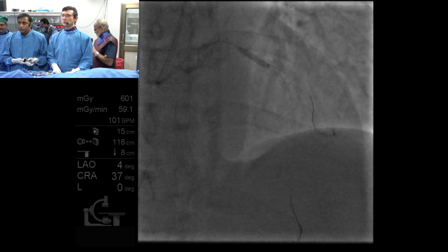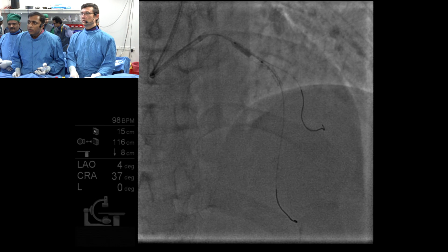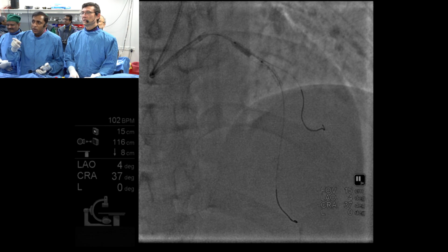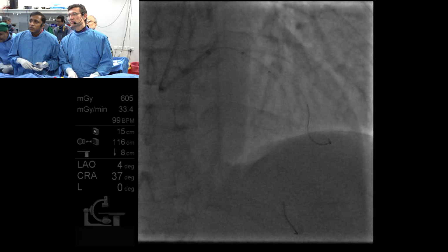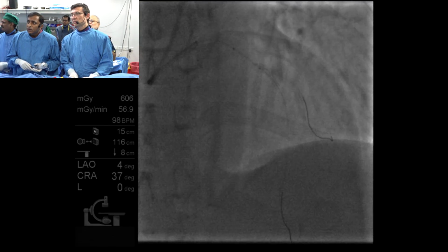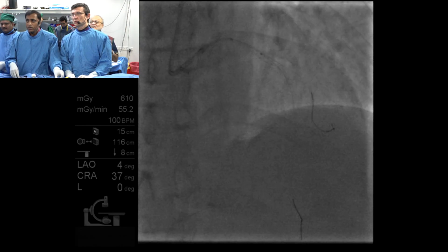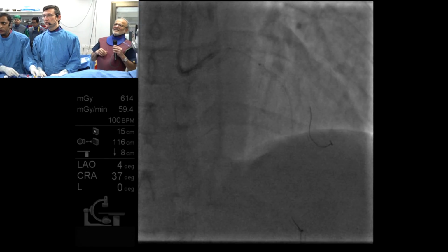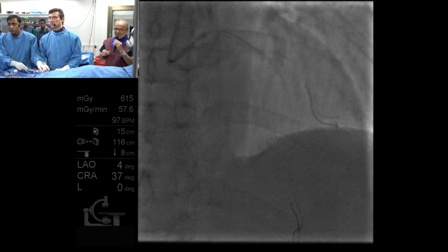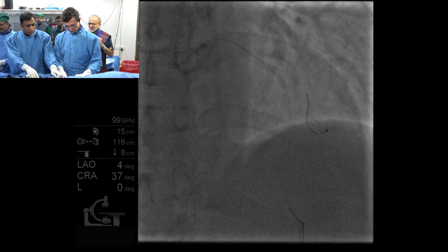The definition of this angiogram and the visibility of the stents is just incredible. It looked like you were doing StentBoost there. No, there's no StentBoost. I understand that, but the quality is so good that it appears to be StentBoost. I have to be careful. I'm retracting the guide because the guide is sucking in here. This big screen, Louis, eliminates a lot of visual fatigue, believe me.